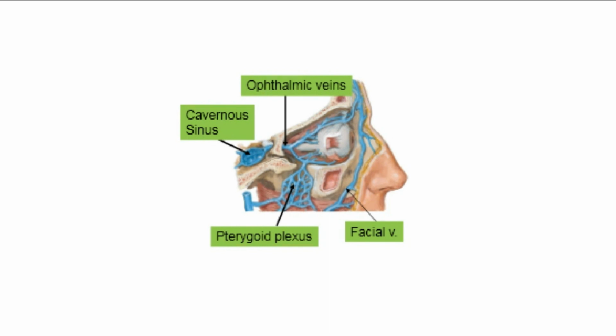So if you pull out the plunger, and there is blood, it means you are in the wrong location. You did something wrong. That's why you have to do 2 negative aspirations every single time you do any anesthesia. It should be something automated. It should be something that goes without saying. You have to do 2 negative aspirations.